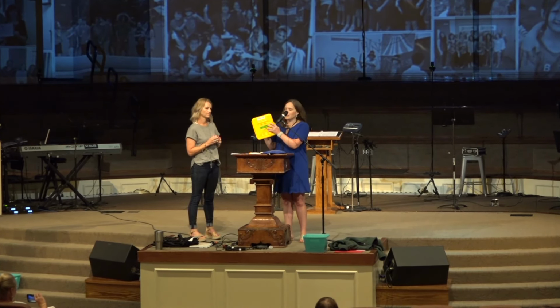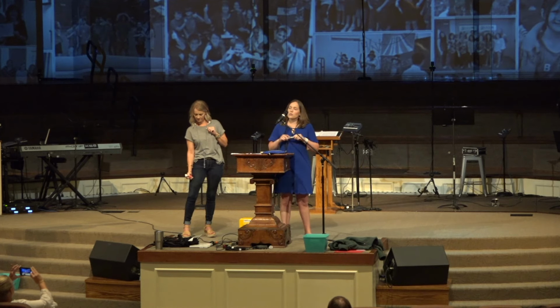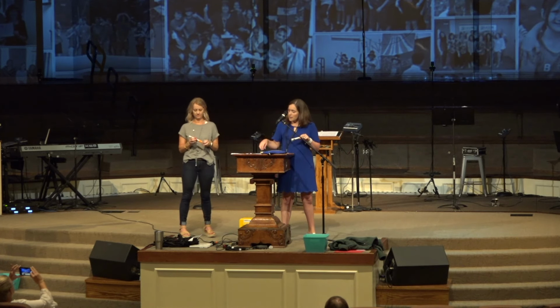Okay. Angela's going to help me just show y'all. These are the trainers. If you've not already used it, you're going to take off the blue tab. And then you're going to position it over your, you can do it over your clothes, anywhere. And then just hold it down at your mid-thigh for 3 seconds. You always want to make sure you call 911 if you use an EpiPen.